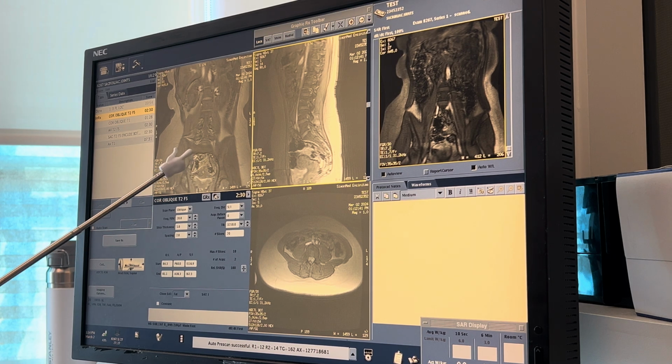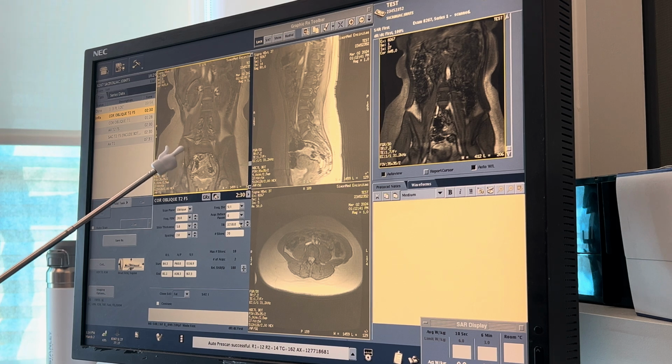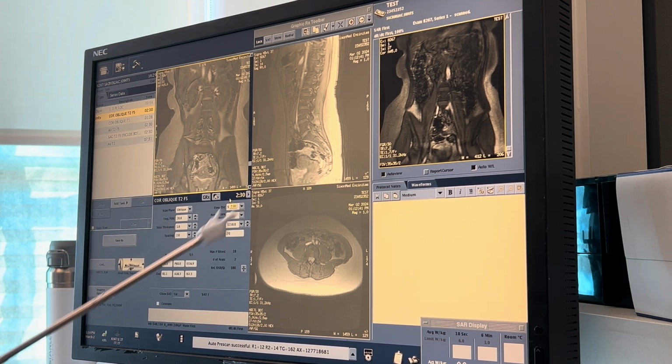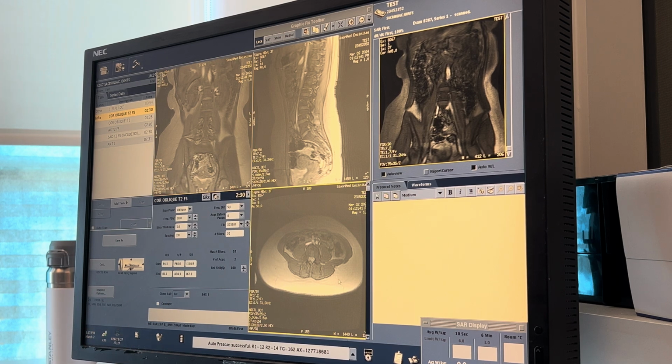So over here you can see the sacrum. You can see that it's much wider than the spine, and you can see these little black lines right there form the sacroiliac joints. So these guys right here are the ilium bilaterally. Okay, so over here we want the sacrum and coccyx down here, and up here we want to see the SI joints. So let's find it over here.